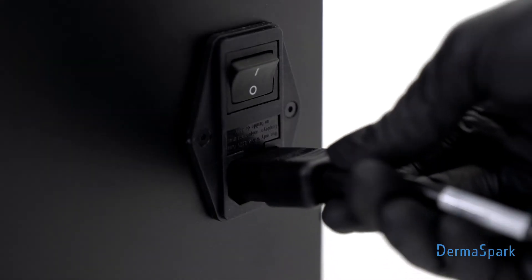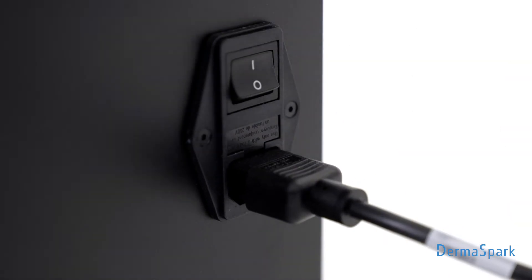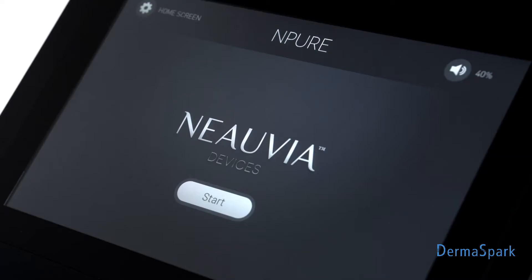Plug the power cord into the socket on the right side of the back and set the main switch to 1. In a moment the device will start and display the welcome screen. Press the start button to open the home screen.